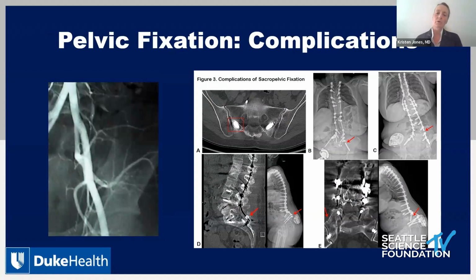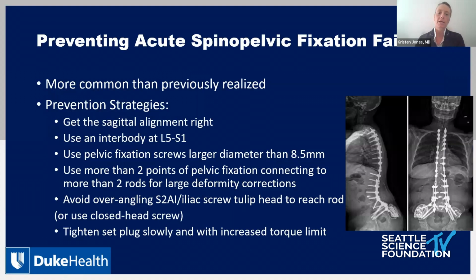So just to say one more thing about complications, I think that patients who have transitional segment anatomy give me great pause, and I am very careful with their pelvic fixation. So I've had a patient who had a low PSO and had transitional segment anatomy and had quite a catastrophic sacral fracture through what was a previously non-mobile disc space at S1, S2. So I just want to impart caution if you haven't encountered those patients, that they definitely need to have multiple points of pelvic fixation placed very carefully to involve more than just the transitional segment.